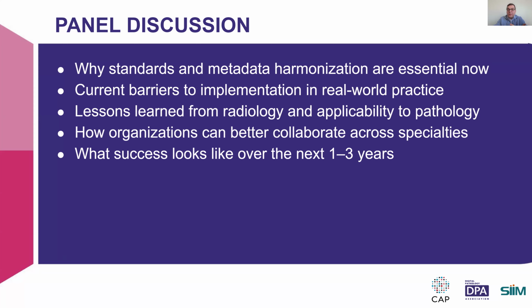So we're talking about petabytes, because the majority of institutions scale it for the next 10 years of archiving. And this is extremely challenging to communicate with your team and educate your institution about: yes, we might need that amount of data, but remember that we're still digitizing a glass slide.